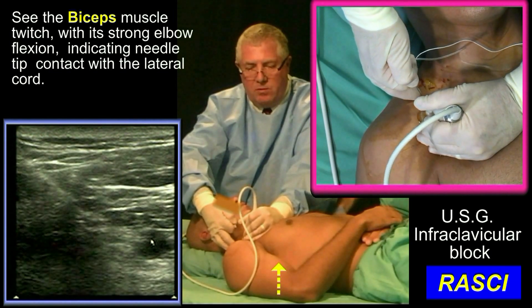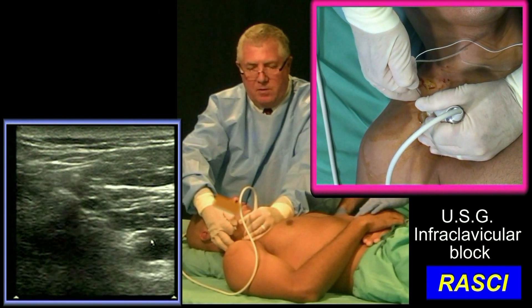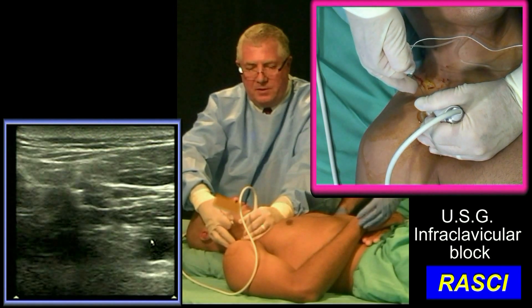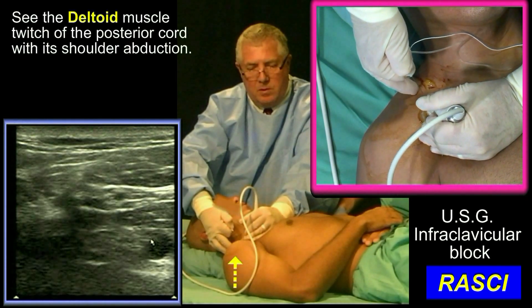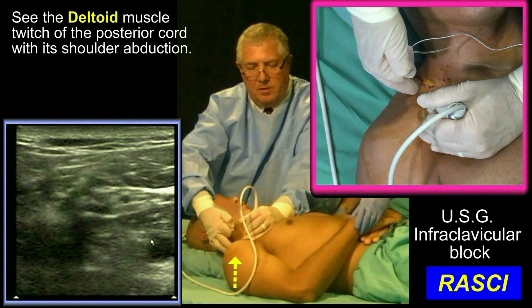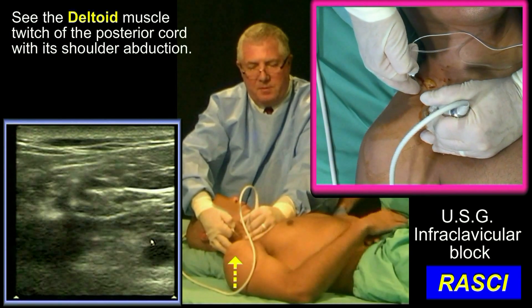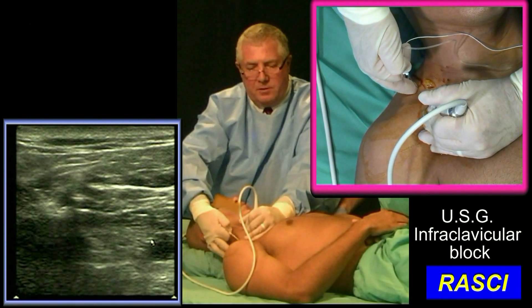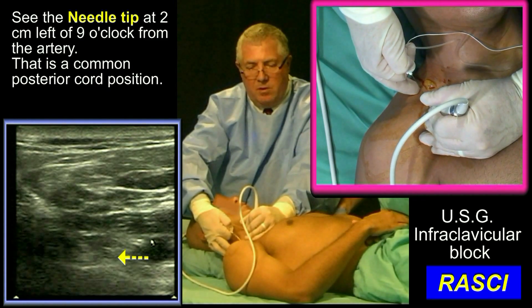We're going through lateral cord. I'm looking for posterior cord. Deltoid. You want to switch off the nerve stimulator. Where the tip of that needle is now, I'm touching the posterior cord. We had a deltoid twitch.